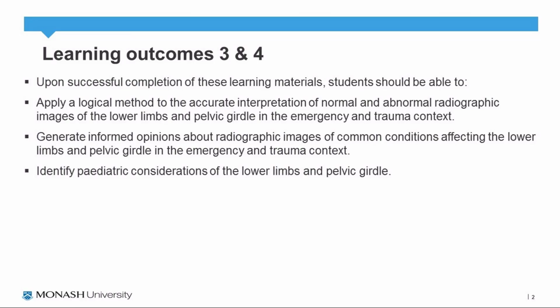This presentation is focused on learning outcomes 3 and 4, and I trust that at the end of the sessions, you'll be able to apply logical method when you interpret normal and abnormal appearances of the lower limbs and the pelvis, especially in the emergency and trauma context. I also hope that you'll be able to generate informed opinions about radiographic images of common conditions and in particular fractures, as well as identifying pediatric considerations for the lower limb and pelvic girdle.